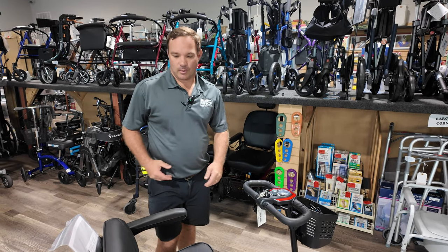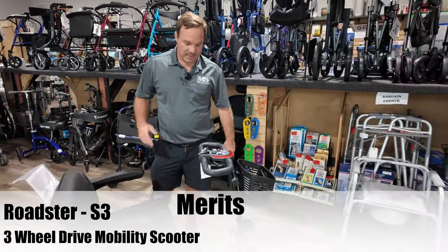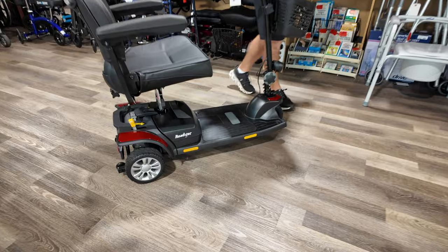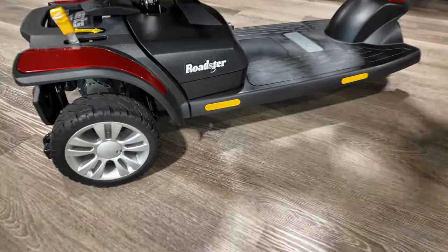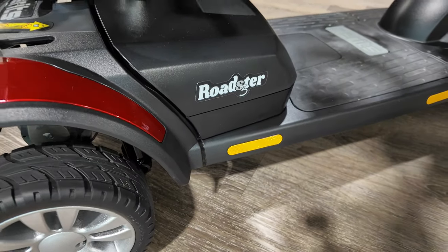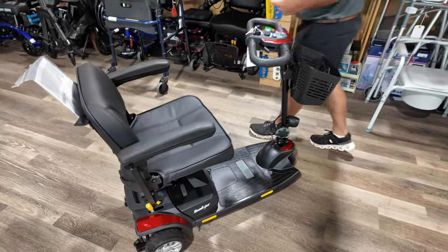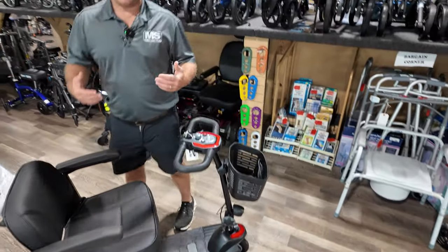I'm Chris with Affordable Medical and I'm going to go over the Merritt Roadster S3. It's extremely similar to the Buzz Around by Golden XL. The three-wheel scooter can come in four wheels. It comes in red or blue — this one is displayed in red. A lot of things I like about it; the price is good.